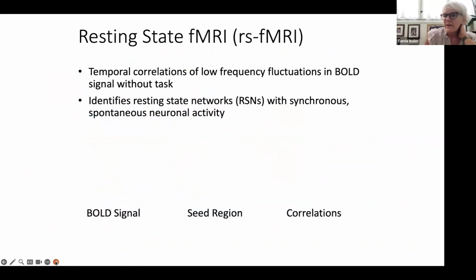There are other ways to look at this, and I'm just very briefly going to explain what resting state correlations are. So when we have background brain activity going in your brain or anybody's brain, there are different areas of the brain that the blood vessels are firing at different rates all over the brain. But some of these areas are firing together, as you can already see.